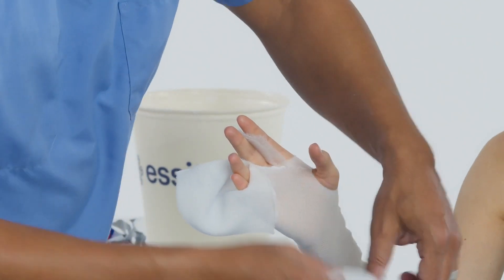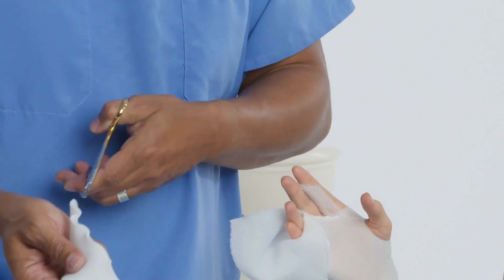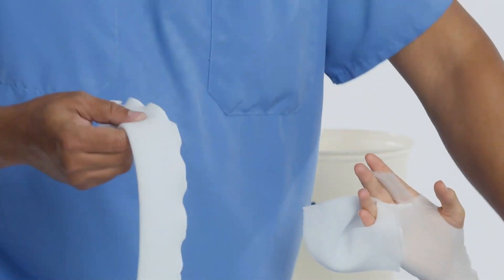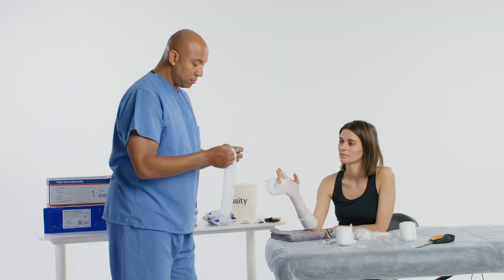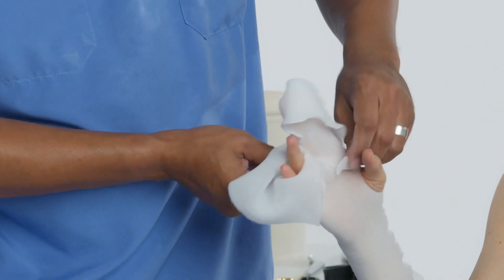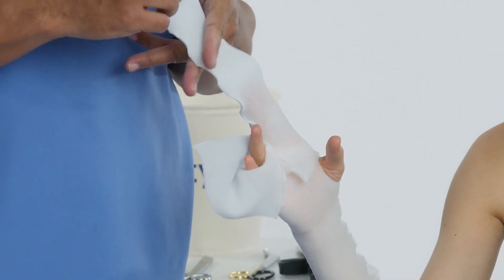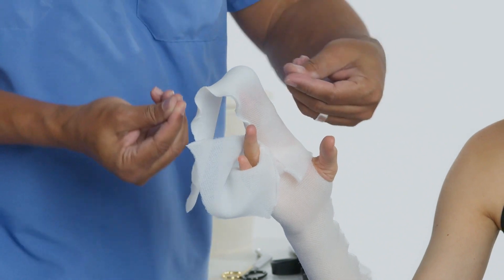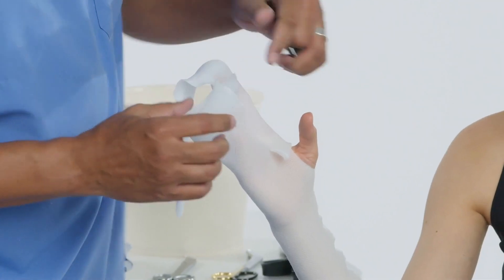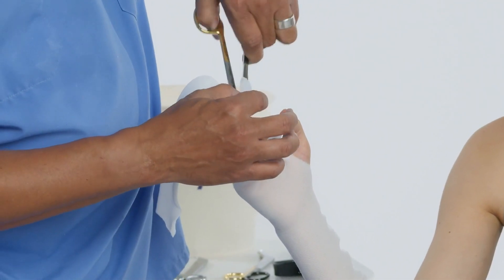Now let's put some stockinette around the fingers. This is the soft liner of Delta Dry. I'll make a little slit inside of the stockinette, and the slit will go toward the ring finger. I don't need too much length, so I'll cut at least half of this off, but I want enough to lay on top of my cast tape. I'll cut it down and tell the patient to bend their fingers, then cut off any extra.